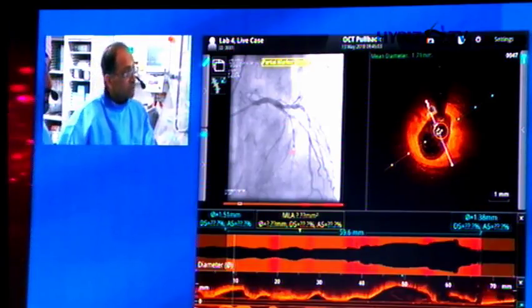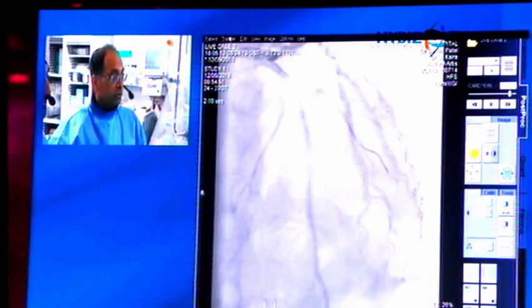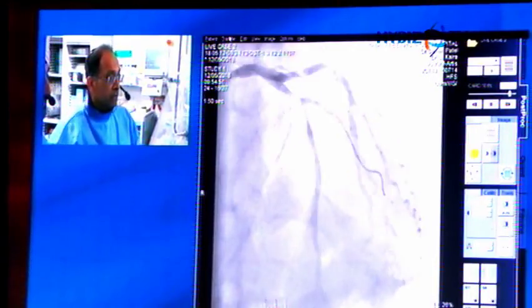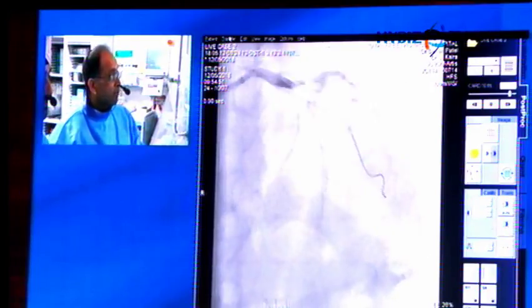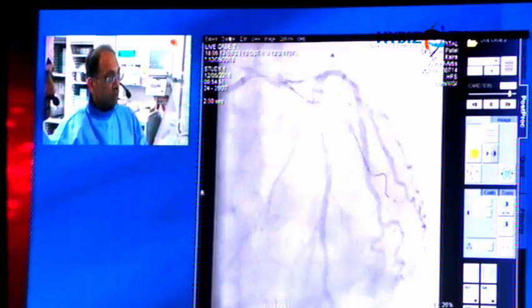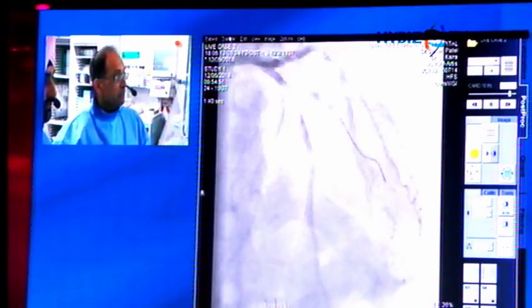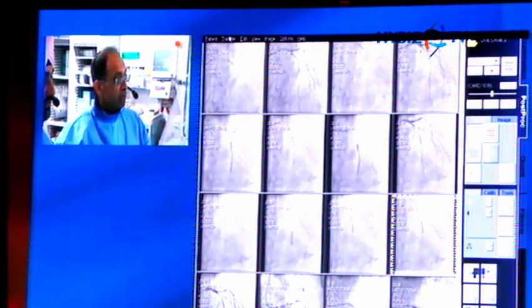So I'm just going to switch to the angiogram here. This is the post-stent dilatation film. Please switch to the angio. And you can see there the moment the stent's deployed, we went quite distal because there's disease beyond that septal branch, and it looks like a reasonable vessel. And at this point, it's relatively straightforward. Can we flick to the page view now? And really it's now a matter of just getting the proximal vessel referenced with a balloon.